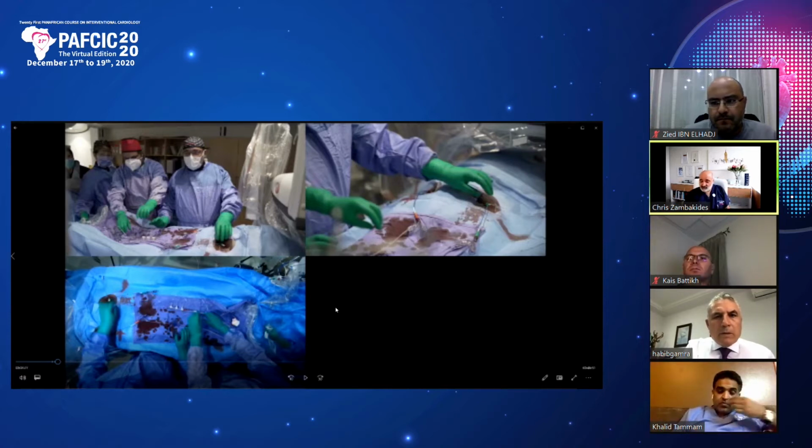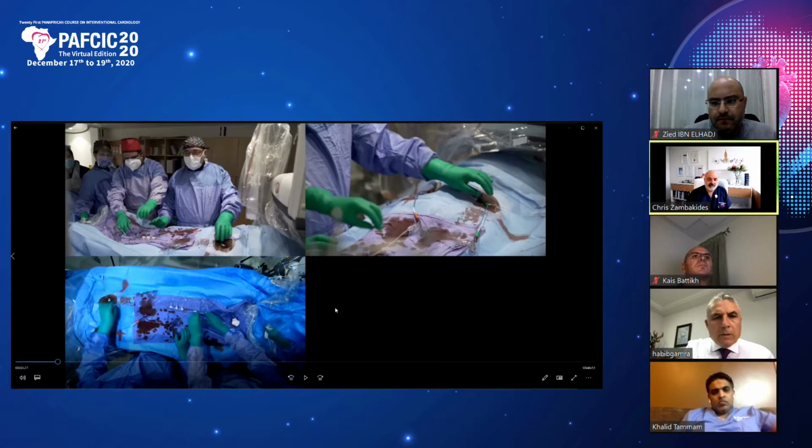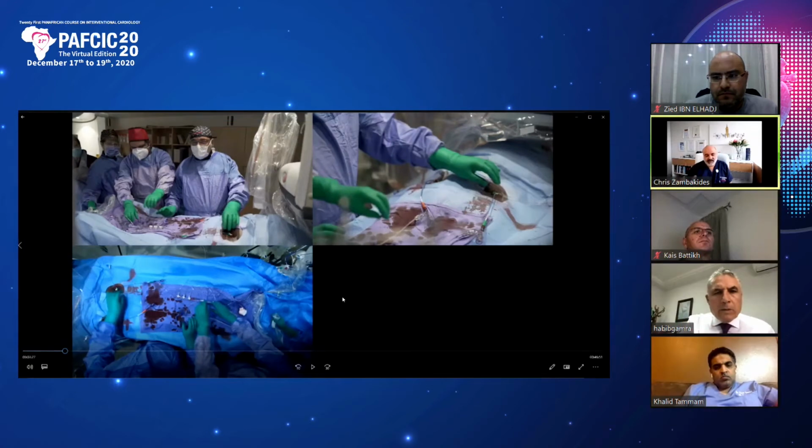Firstly, because it was reattempted quite recently, and the person that attempted it had gone subintimally, and I think there was still a dissection there. So I was worried that we wouldn't actually join. And also that distal vessel was so diseased, to try and save the bifurcation, I thought it would be safer to go retrograde. But I agree with you, the majority of my cases, I'm going to start doing some antegrade work. If we're lucky and the wire slips through, it's done. But if not, you've already done some of the work for the reverse CART.